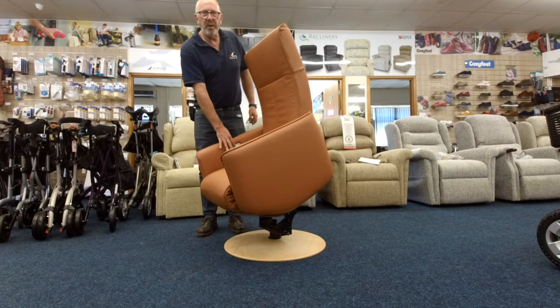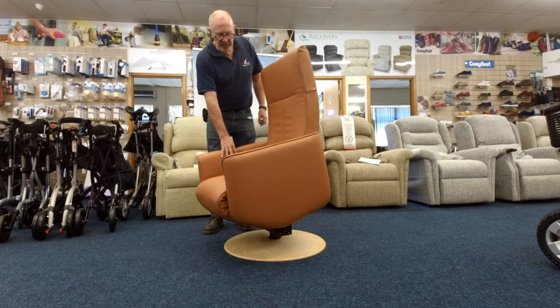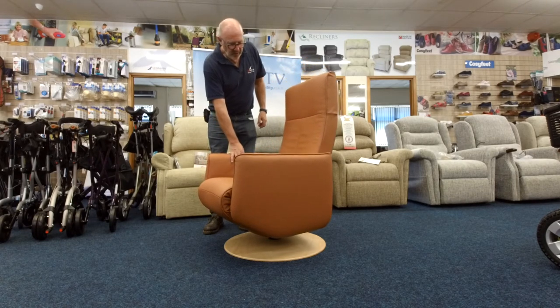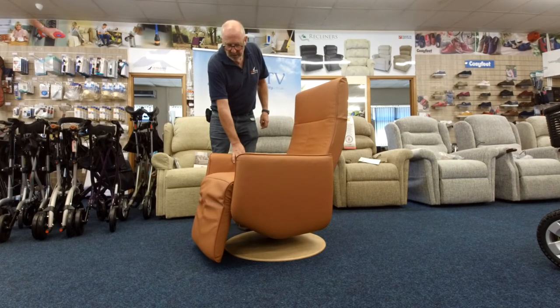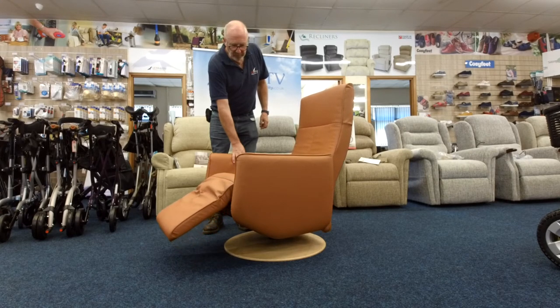Maybe I should have practised a bit more beforehand, but you soon work it out. Down it goes, repress, and up comes the footrest. They are wonderfully comfortable.